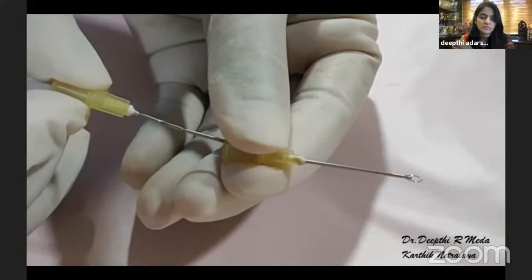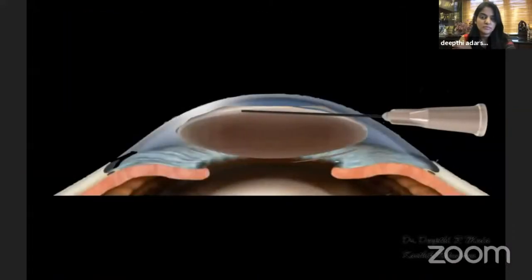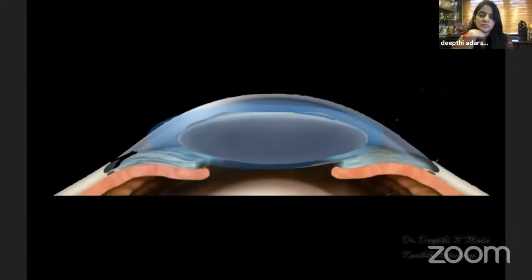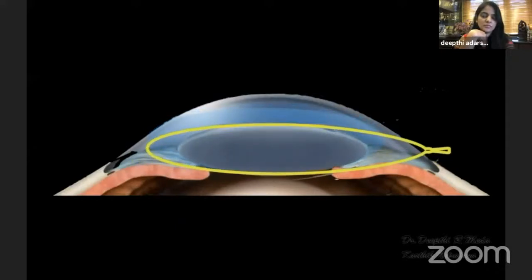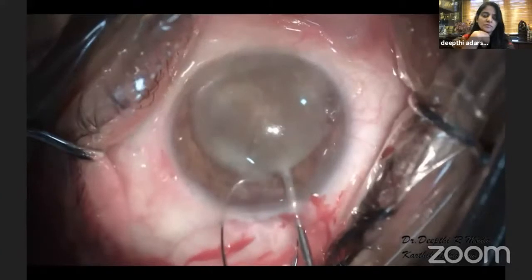Snares are commercially available or can easily be made in-house by simple instrumentation. First, the anterior chamber is deepened with a dispersive viscoelastic. The snare is horizontally inserted and slowly made vertical, thereby belting the nucleus. The snare is then firmly yet slowly pulled to split even the hardest of cataracts with quite an ease.